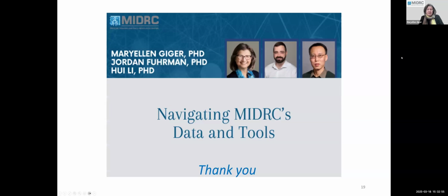And anyone using these tools, please feel free to send us feedback. We pass it through many users to get it right. We want it working well, but also user friendly. And we are very much open to comment. I can leave a question too.